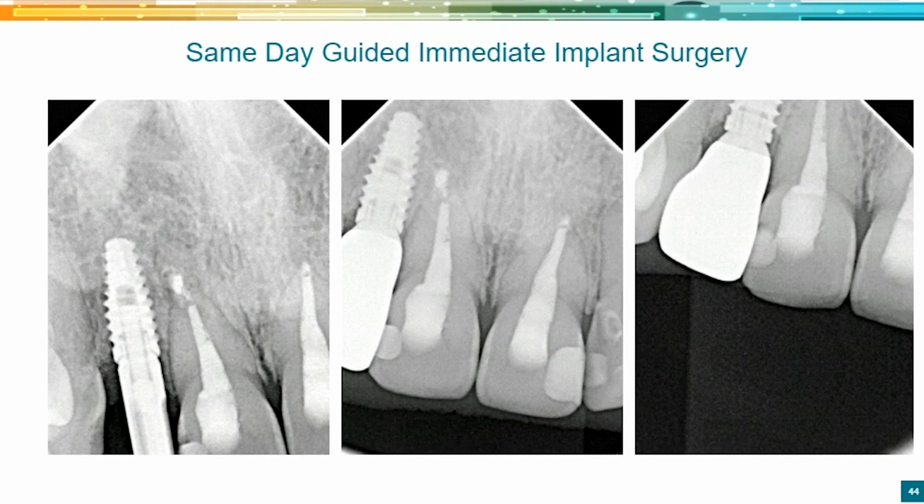So it's a really nice thing to be able, once you get comfortable with the software and you bring this all in-house, you can do this in less than 2 hours. I mean, same day. And I did it a lot in private practice where someone would come in through hygiene with an edentulous site. Hey, we've thought about doing an implant. Yeah. Strike while the iron's hot. Let's get it done today. Go have lunch. When you come back at 1, we'll do the surgery. And so over lunch, that thing's printing.